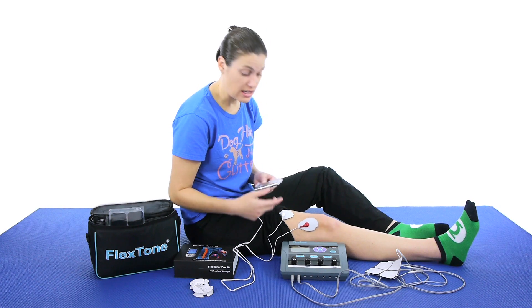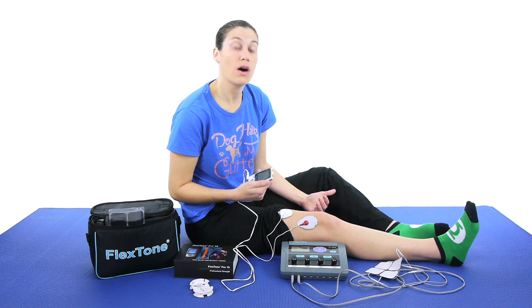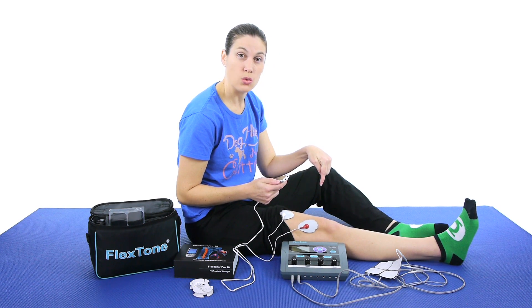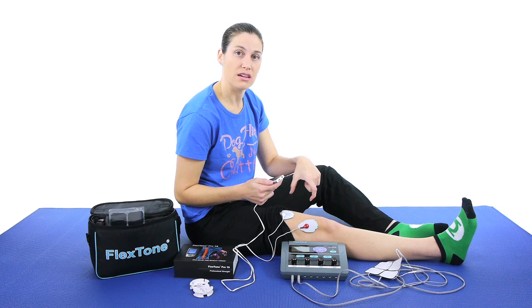So what you can do with this when you're doing the muscle contraction ones is do an exercise while it's on there. I'm going to do a quad set. Once I feel that it's going to contract the muscle, then I push down and squeeze that muscle as much as I can while it's giving that stimulation in there as well.